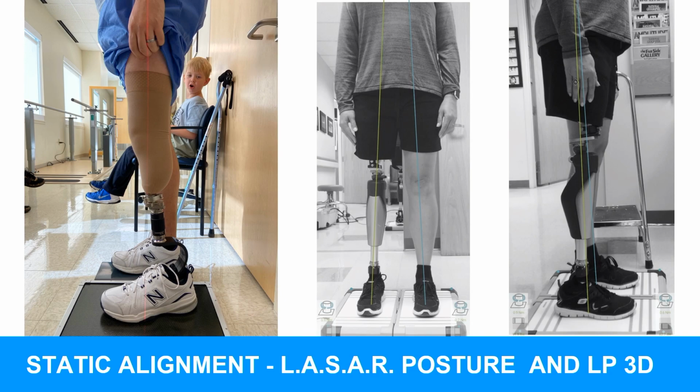In these early stages, they're not walking yet. They're shifting their weight. Probably 8 days from now, when they start walking, I could have predicted this alignment, but I can actually predict it right now looking at the ground reaction forces that are basically invisible to me.